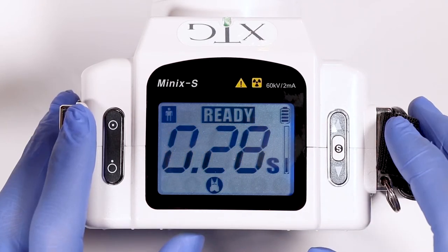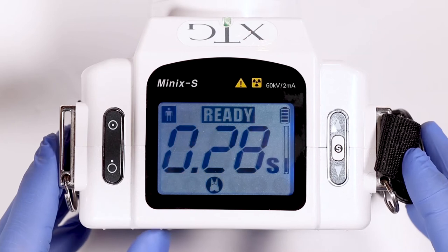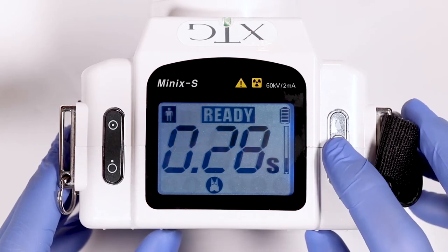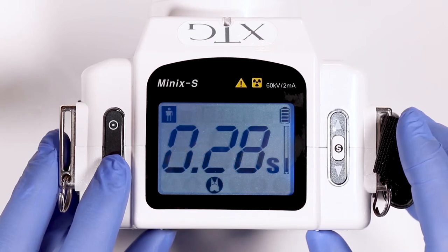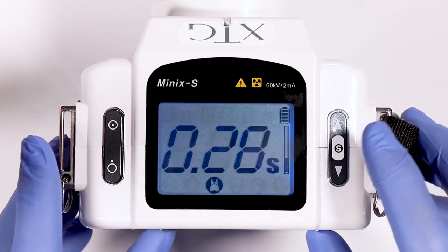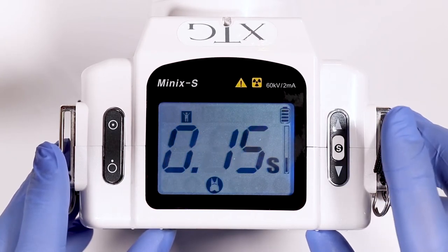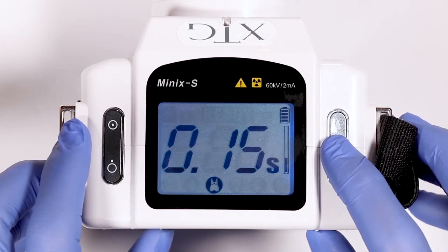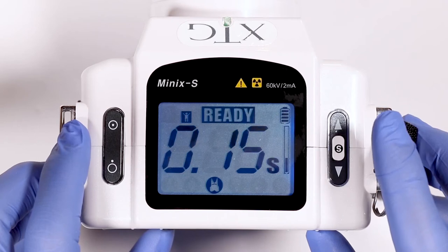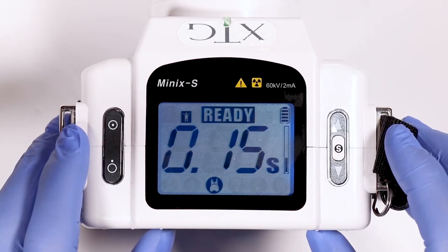To change from adult to pedo, press and hold the S button for 2 seconds. Press the power off button. The adult icon will flash. Press and release the S button and it will change to pedo. Now hold down the S button and it will save to the pedo mode.